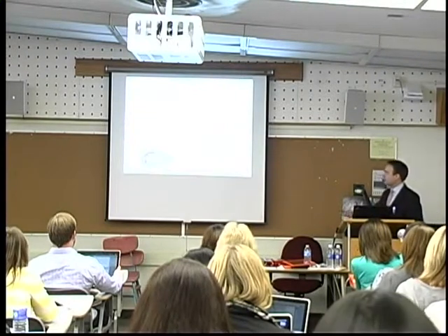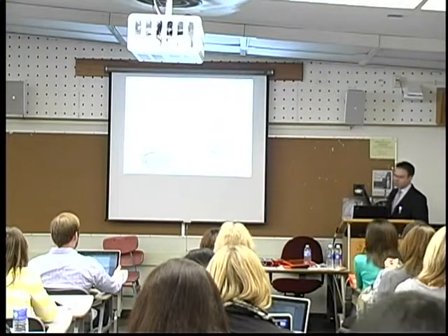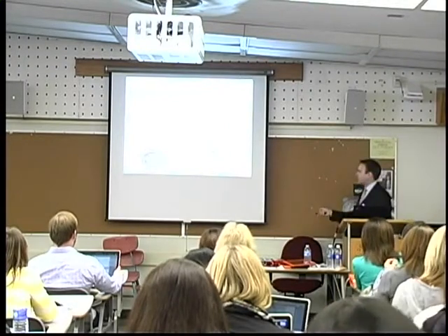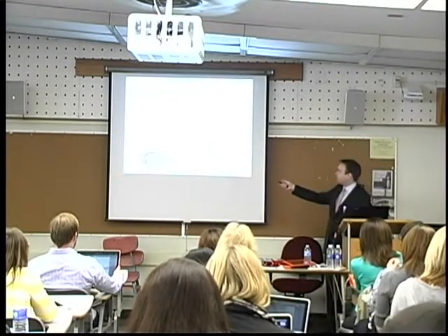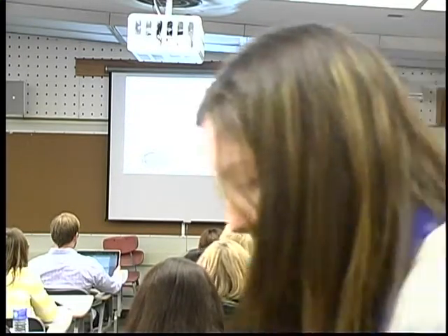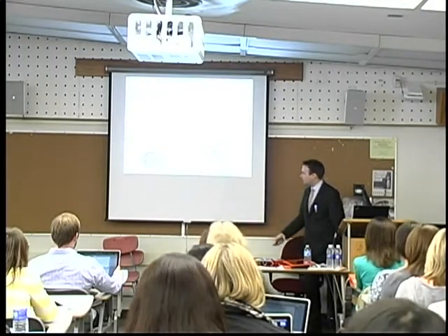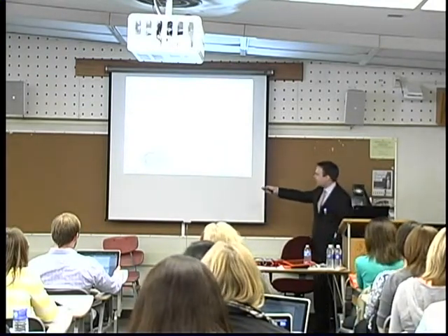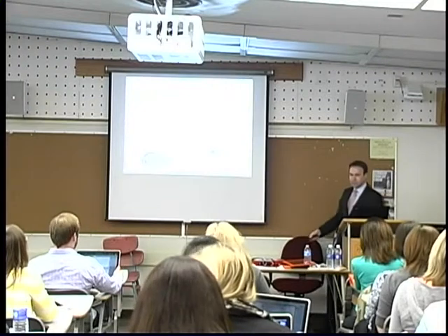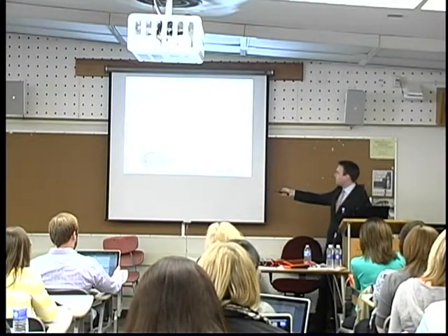Important to know about SGDs is that they can either come with a fixed display or with a dynamic display. With a fixed display, we're a little bit limited in the amount of symbols that we can display at one time. We might have a limited vocabulary because that overlay stays as it is. We might be able to replace it with a different overlay, but that requires that we create a new one and swap it.